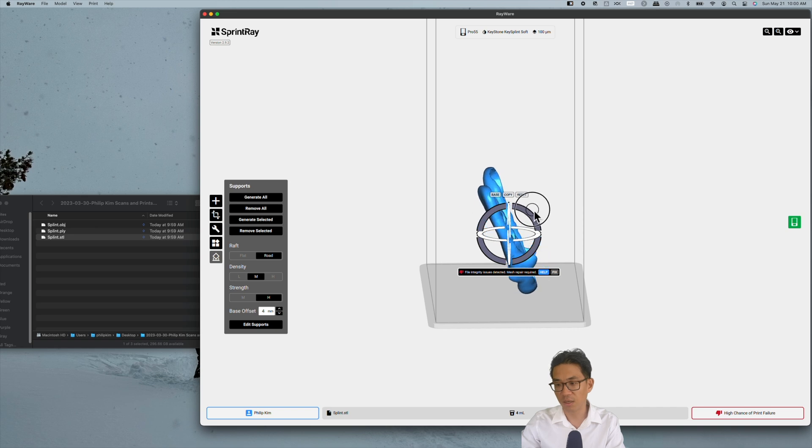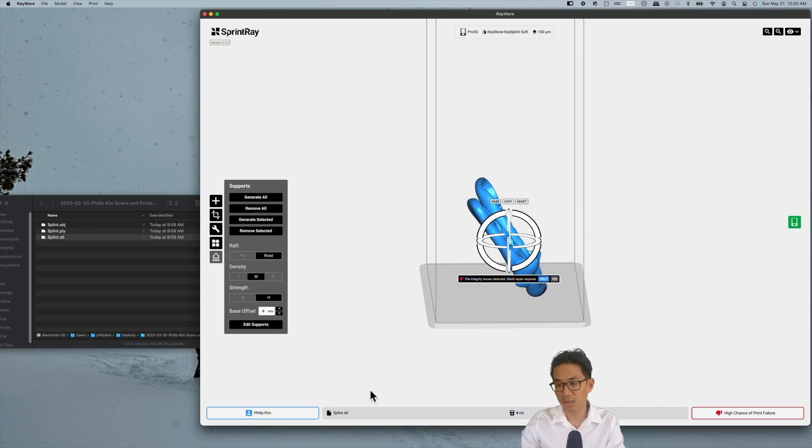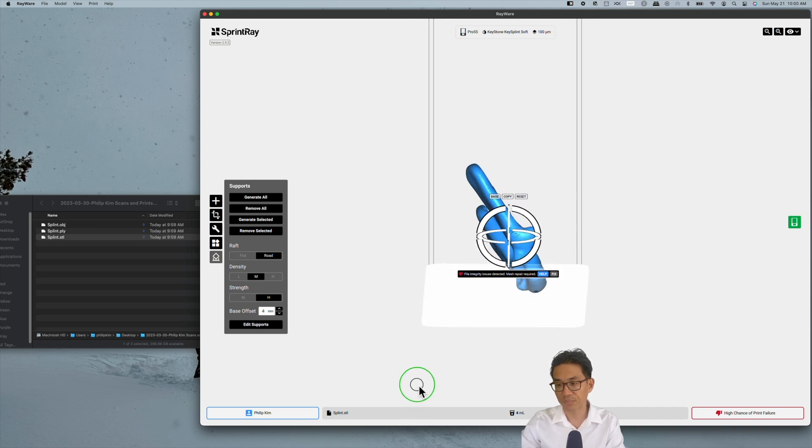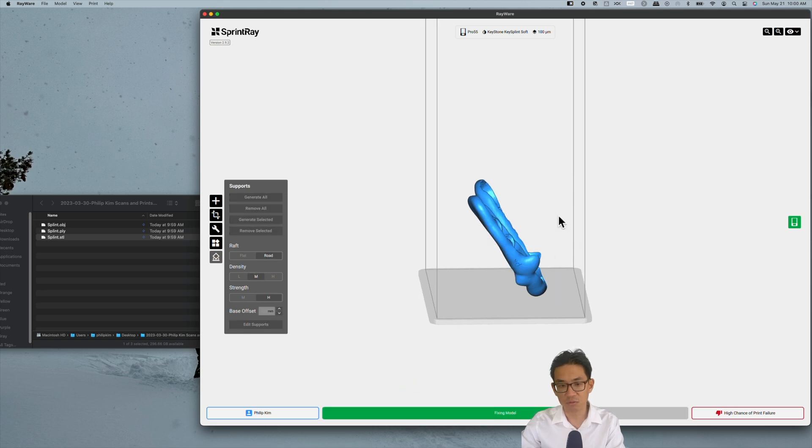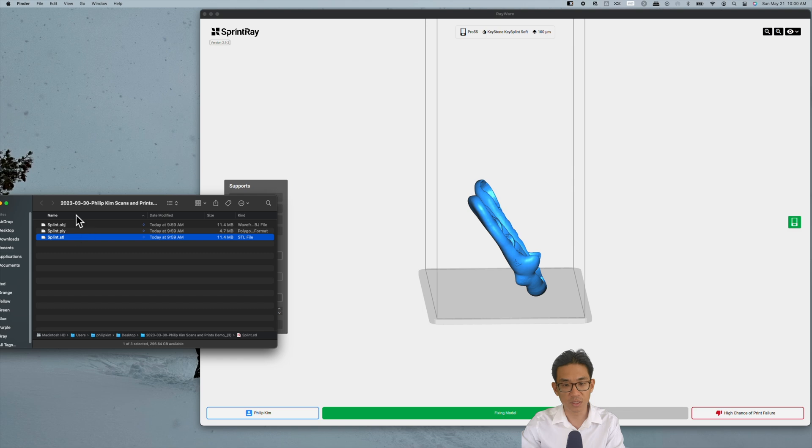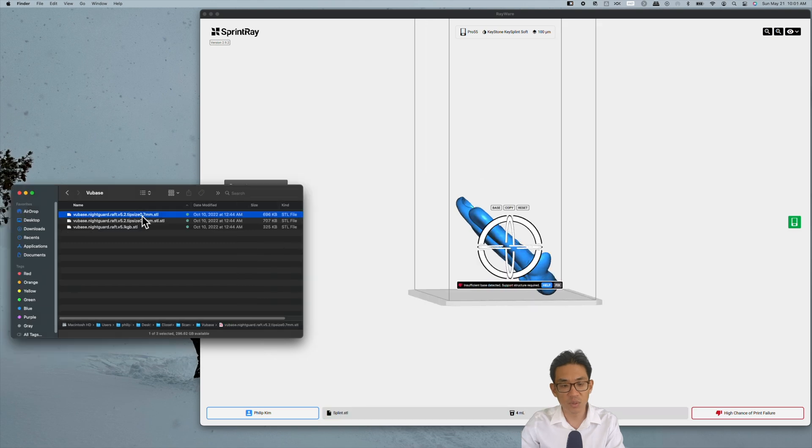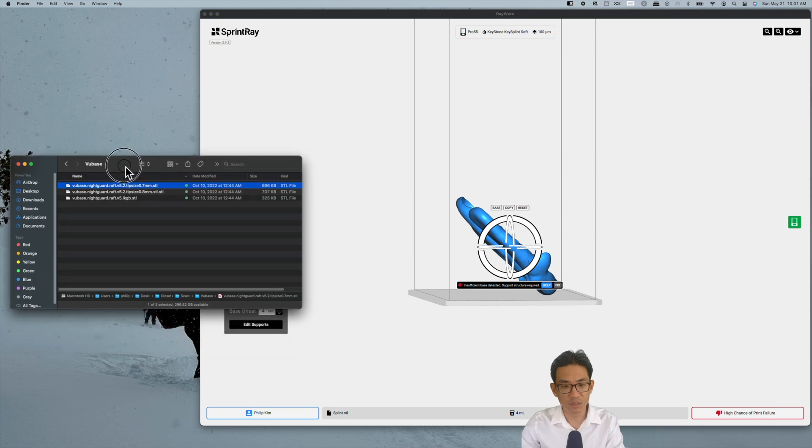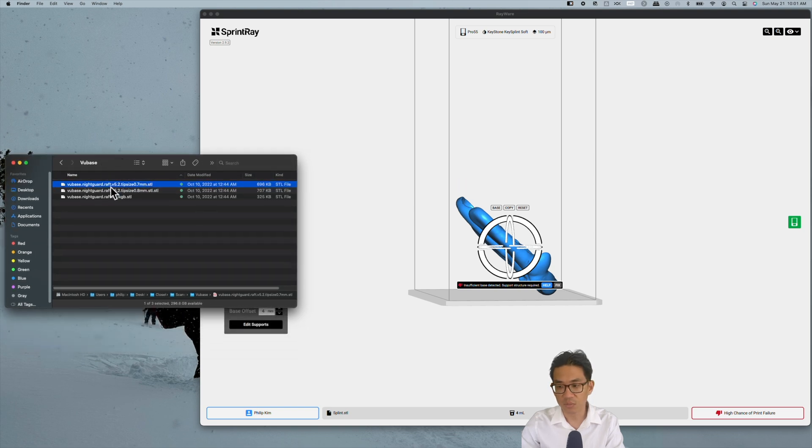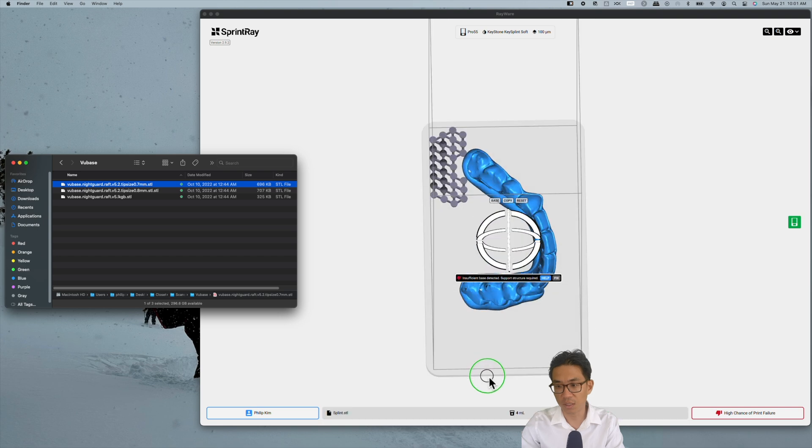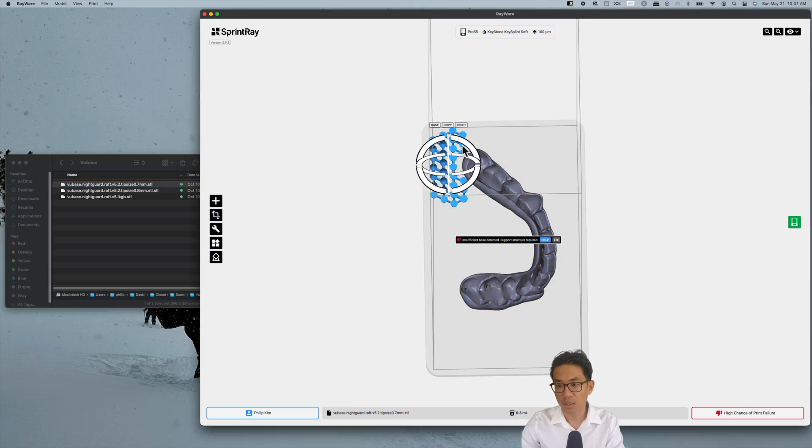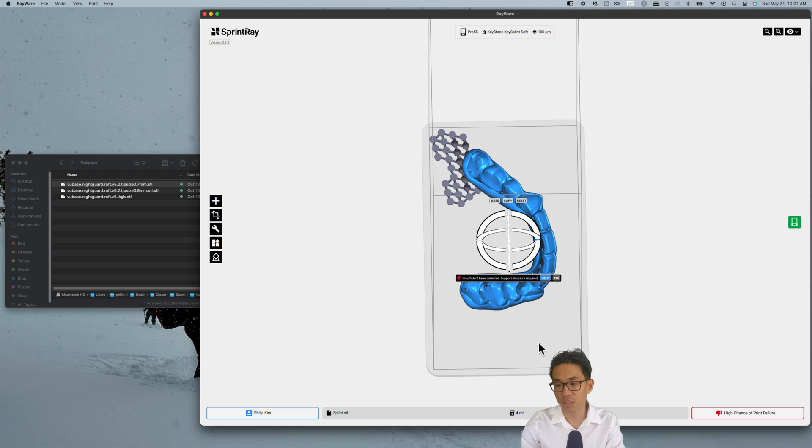There are integrity issues so we just hit fix up and the software will deal with that. This VuBase night guard, you can Google it. It's available on a lot of free sites. Basically you want to drag this in here as well and add this under.